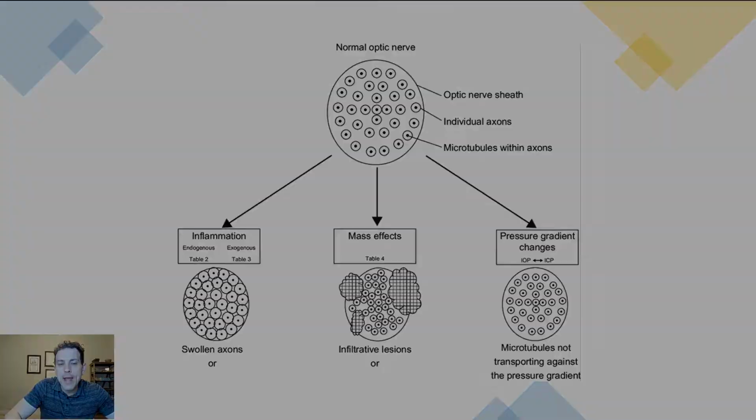So why do I mention that at this particular juncture? Well, as we look at measurements of the optic nerve, you're going to see that it looks like a shadow, and you're measuring a black tubule. There has been some discussion that perhaps you're not measuring the optic nerve itself. Perhaps you might be measuring that lamina cribrosa shadowing that comes down.